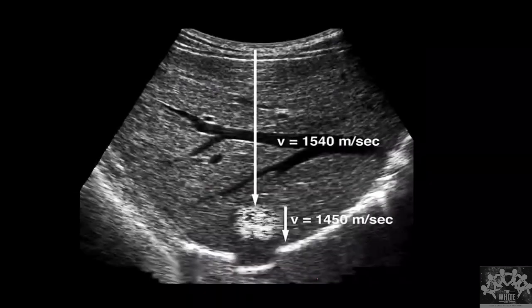Yeah, so this is again an image of a liver. What do you think this structure inside is? What do you think this black thing is? Yeah, it is a vessel. Good. So that's all we need to interpret as of now.